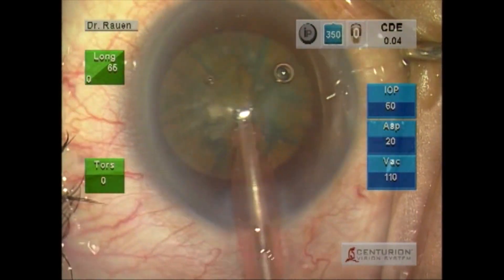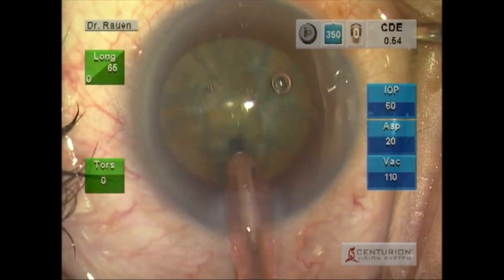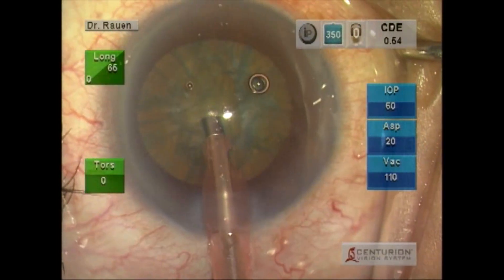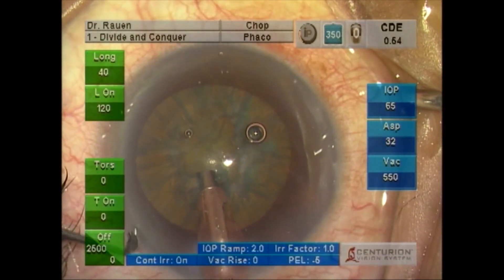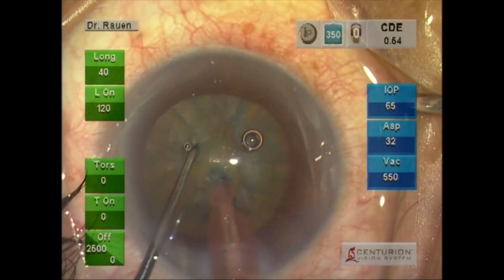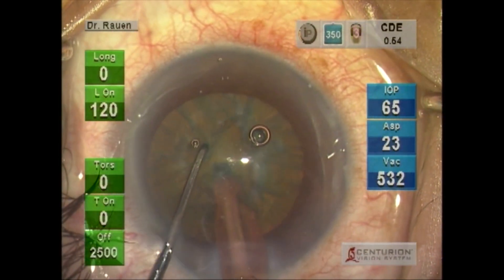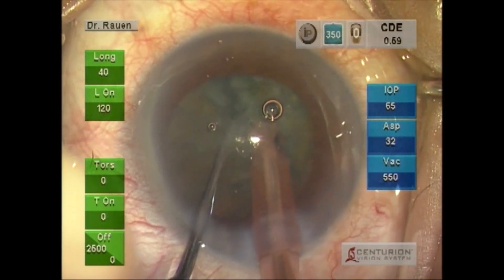In addition to that is the active fluidics that it employs, which leads to a very stable anterior chamber throughout the entire procedure. We'll begin this procedure by a chopping technique and will fracture the lens into multiple pieces.